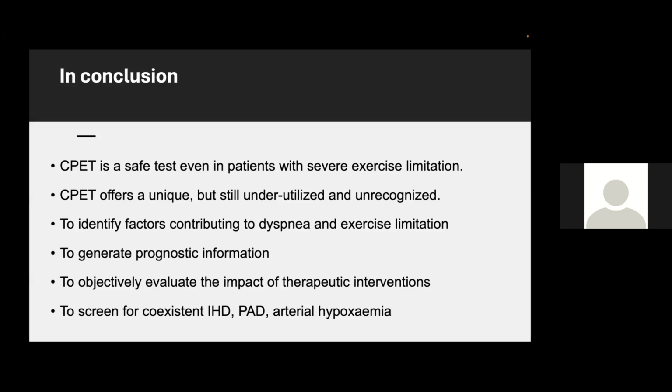CPET is a very important tool, and it's very helpful. And I recommend everyone use it for their patients.